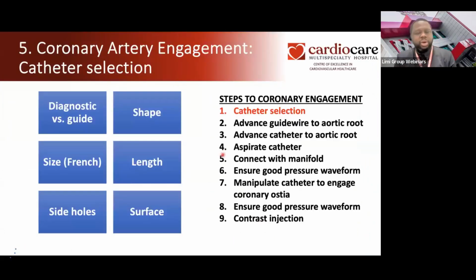We select the catheters correctly. Now, selecting catheter, there are a number of things to go into, but I will not go into, since this is not an interventional cardiology class for senior registrars or for consultants. But there are things you should consider, whether you are using a diagnostic versus a guide. I will explain to you.